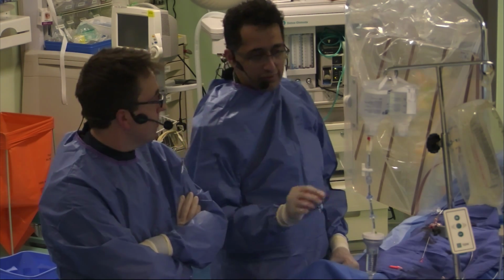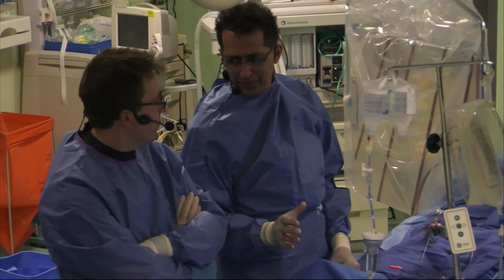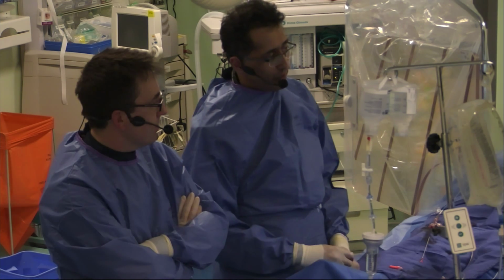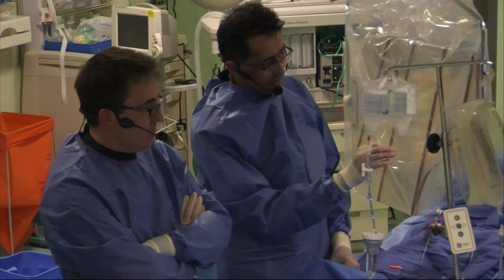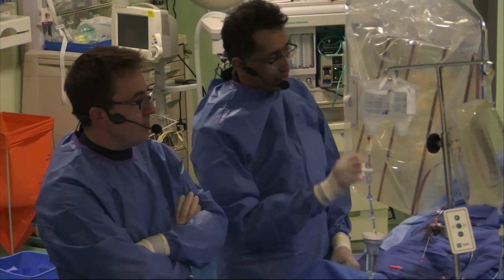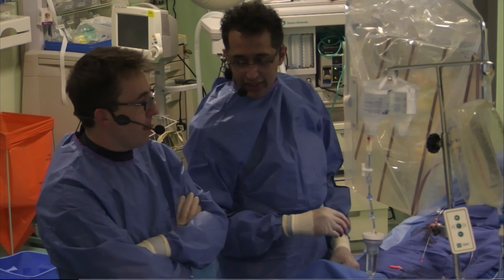So the patient needs to be linked in with the physiology to make the final decision, because there's no black and white in medicine, it's all grey. But I think you help yourself by being meticulous at every stage. So again, we've checked the guide catheter position, we checked for the dicrotic notch. He's nicely asleep, this patient, so the swing you're getting is a respiratory swing as he snores.